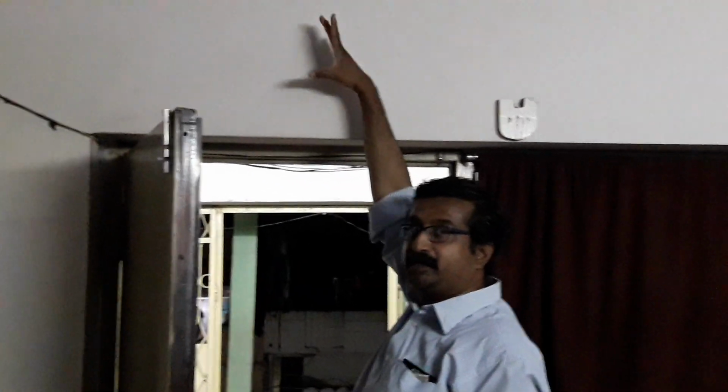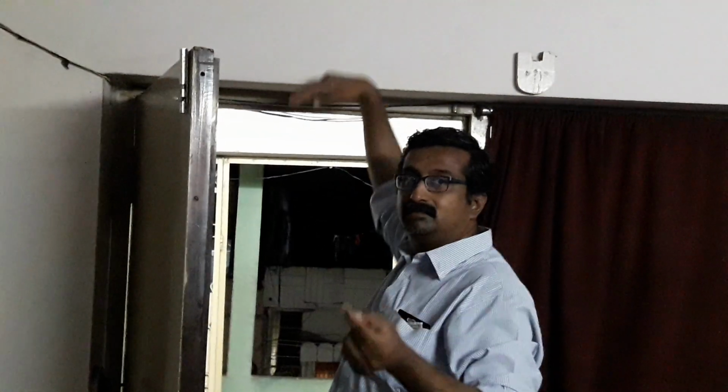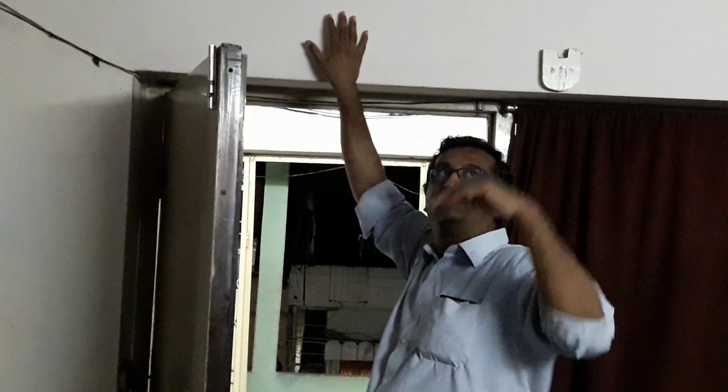If you keep a 70-degree scope, you can still identify this small bone. So this becomes an important landmark to prevent injury of the anterior ethmoidal artery, that is the tube light present in the roof. Actually the fan is there, but if there is a tube light, that becomes the anterior ethmoidal artery.